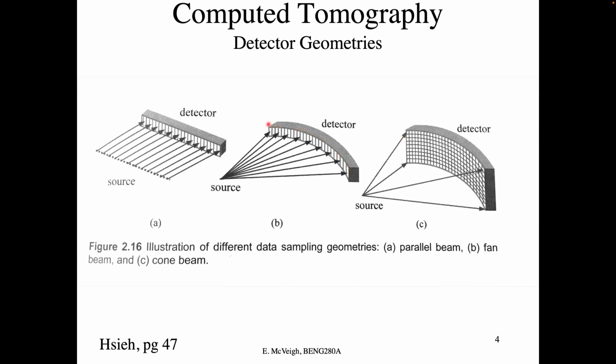But in looking at the resolution here, we have to ask, what is the benefit of, say, using twice as many detectors in this dimension? So I've got 1,000. What would the benefit of having 2,000 be? Does that give me a much better spatial resolution in my final image that lets me see things that I couldn't see before? So that's that sampling issue.